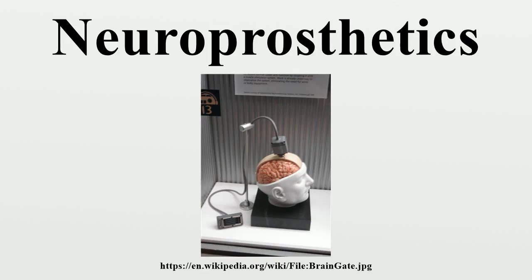Programming options are very numerous. The current devices use computerized equipment to find the best options for use. This reprogramming option compensates for postural changes, electrode migration, changes in pain location, and suboptimal electrode placement.